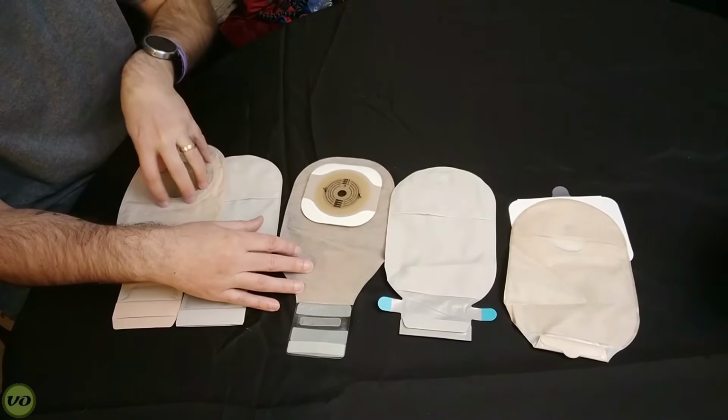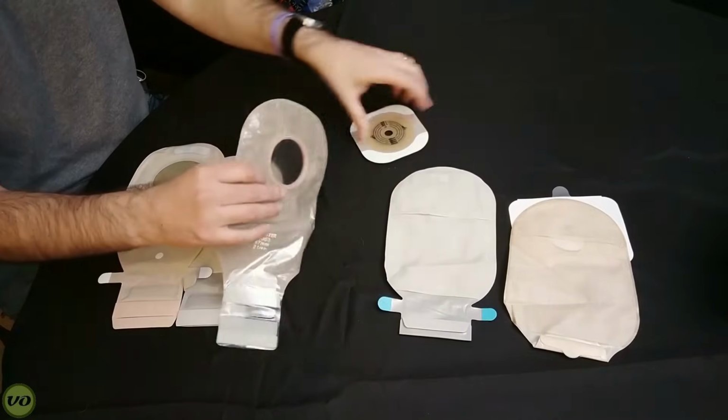Now, one little thing that I have noticed when I'm wearing a two-piece system that really bothers me about a one-piece system is the fact that while a two-piece system might be a little bit thicker because of that extra plastic on the flange, I find that that little gap of plastic acts almost like a stoma guard of sorts. So, for example, if you have any kind of impact and you're wearing a one-piece system, there is literally nothing protecting your stoma from that impact. Whereas when you're wearing a two-piece system with a mechanical coupling, there's at least a little bit of a buffer there so that anything that hits or tries to hit will actually be hitting that plastic part rather than your stoma. So I find that actually to be a big advantage when I'm on roller coasters and other such fun things like that. So that's one thing to keep in mind if that's a concern for you. But for most people, you probably don't have to worry about that.